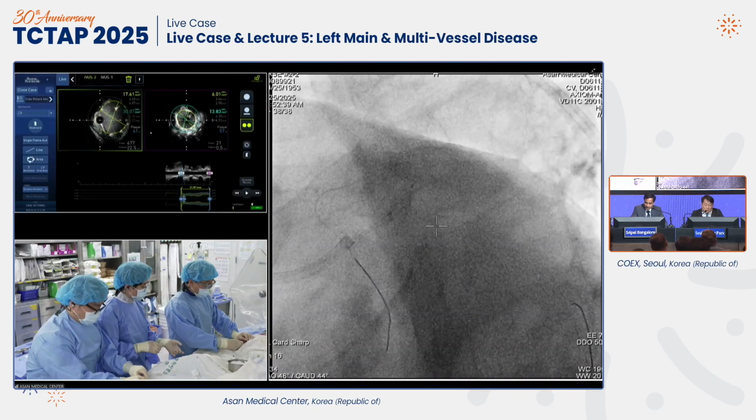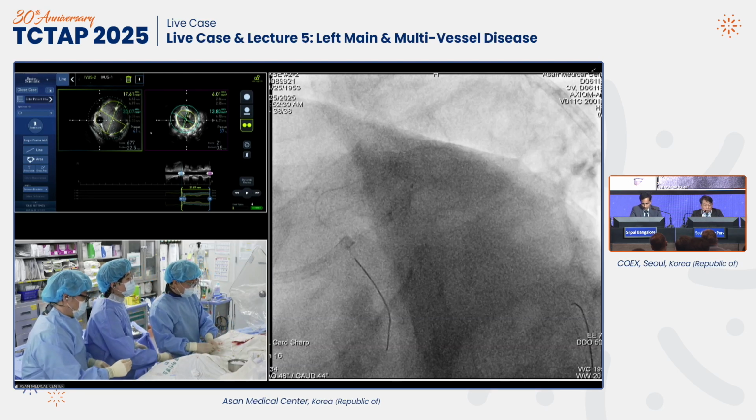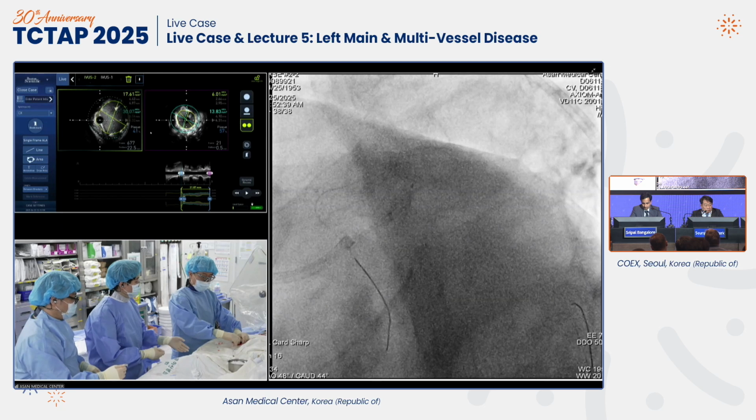Okay, I applied a very aggressive NC balloon using 3.5 after seeing coronary angiography, and the panel had additional comment.